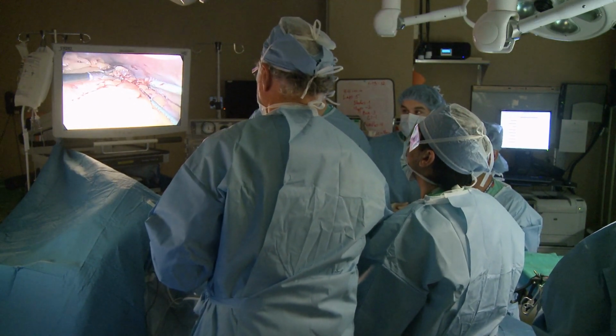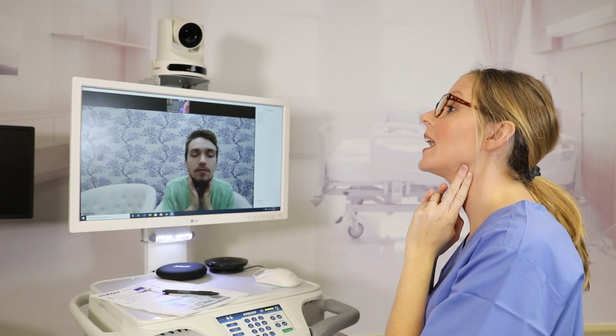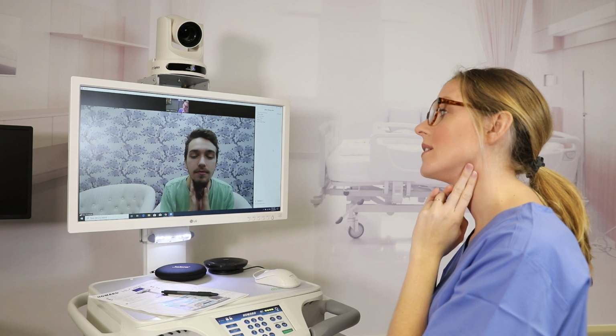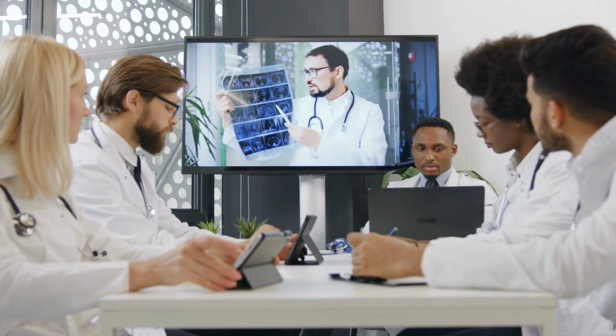of the instructor easier. You can learn more about the technical implementation of vMix shortcuts and voice commands in a document that we've prepared at ptzoptics.com/voicecontrol. This surgical video recording system checks off a lot of must-have boxes for modern educational and healthcare institutions.